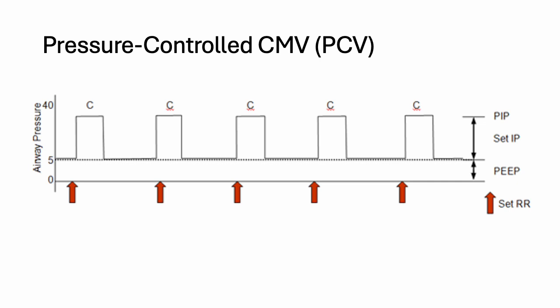So graphically, you will notice that all pressure type ventilation, when you compare this to the pressure support ventilation graph in the previous few slides, they look the same, right? Pressure time graph, and it's all squarish or rectangleish. Okay, square type waveform. So on a pressure time curve, whether it's pressure support ventilation or pressure controlled ventilation, the waveform will look the same, similar. Okay, square.